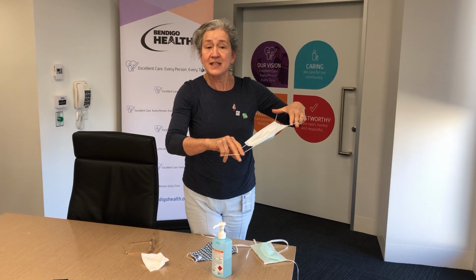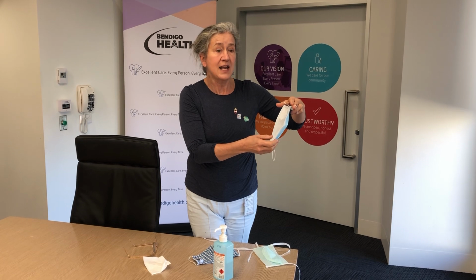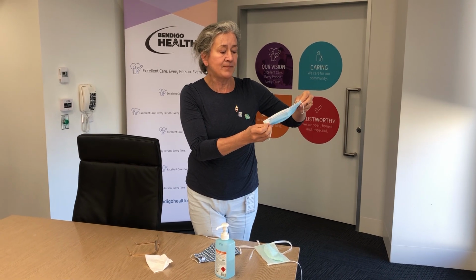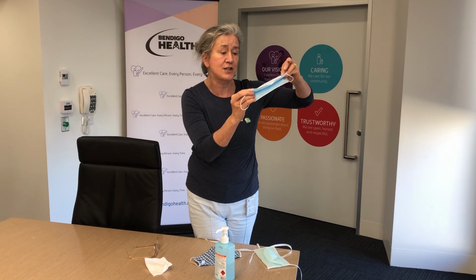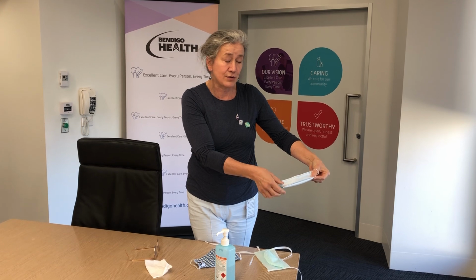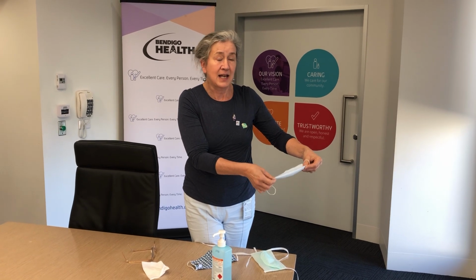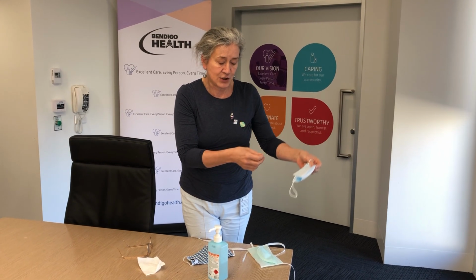Now, if you haven't had this mask on for too long and it's still dry, it's still clean, what you can then do is put the dirty side to dirty and then store it in a sealed bag to reuse. Other than that, it needs to be disposed of and start afresh.